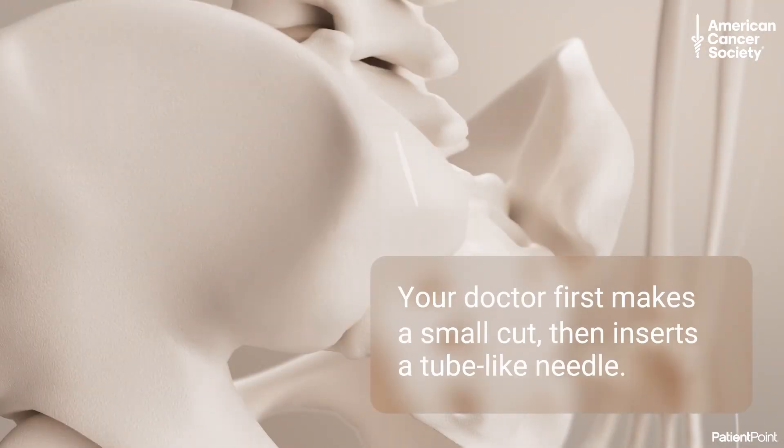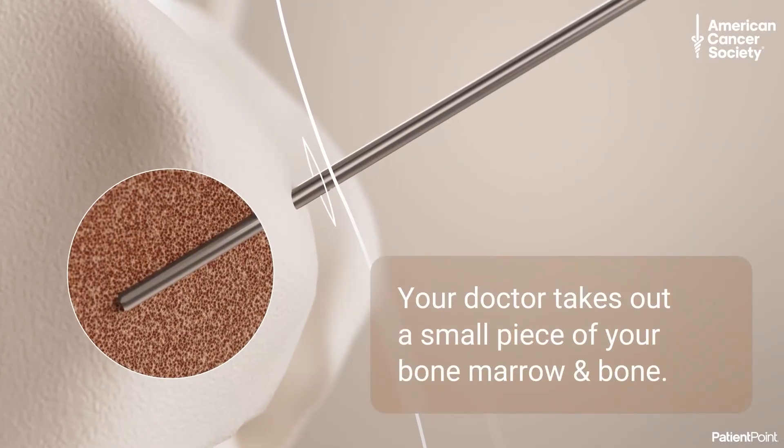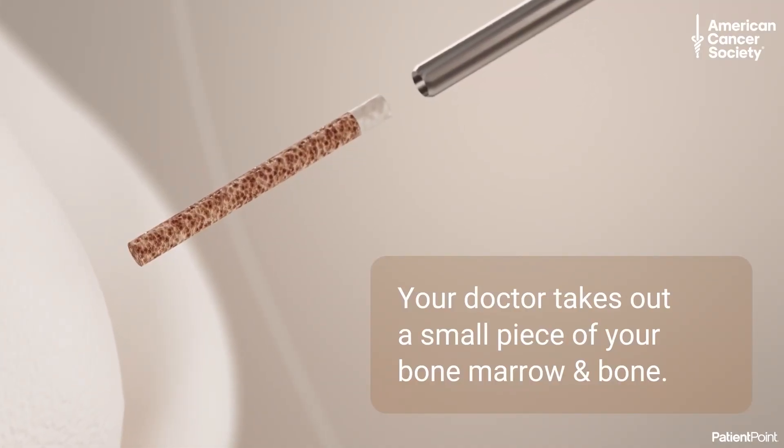Your doctor first makes a small cut in your skin, then inserts a tube-like needle into your bone marrow. Your doctor uses this needle to take out a small round piece, or core, of the spongy part of your bone marrow plus a tiny piece of bone.